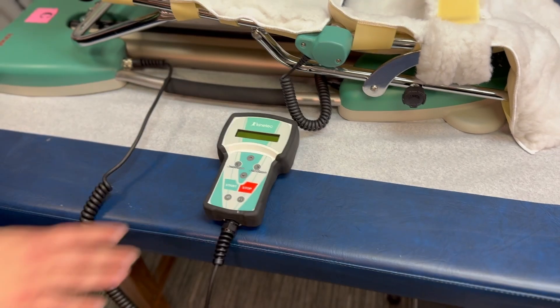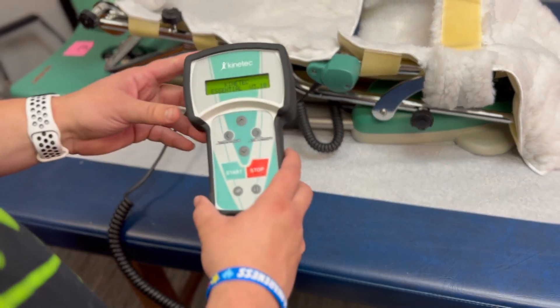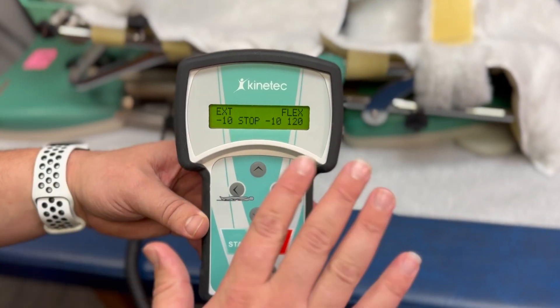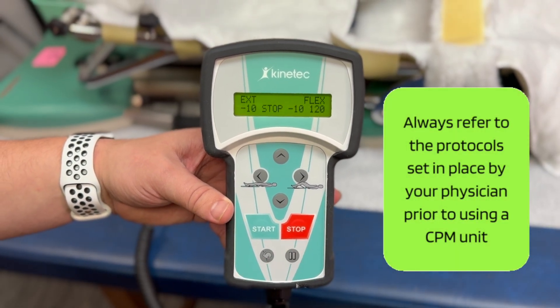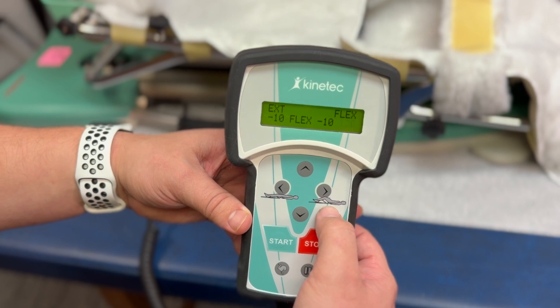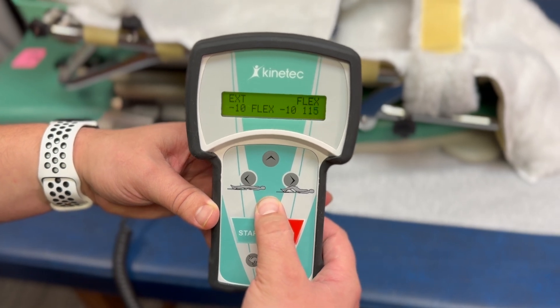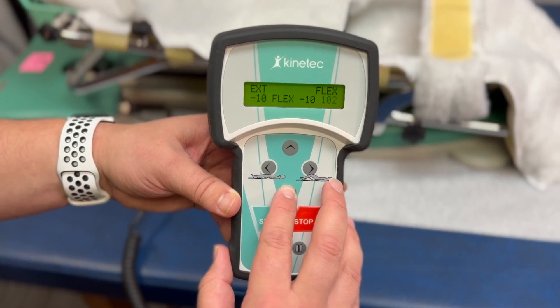This is going to be your controller. Each device has a switch located next to the power cord. As it turns on, it does take a little while to load. Extension is set to negative 10 — you always want to keep that at negative 10. You always want to have the leg completely straight, or as directed by your doctor. You can adjust the flexion and the extension by clicking on these buttons. You have an icon of a guy bending his leg and a guy with his leg completely straight. Some doctors like to start off at 90 degrees when you first start.